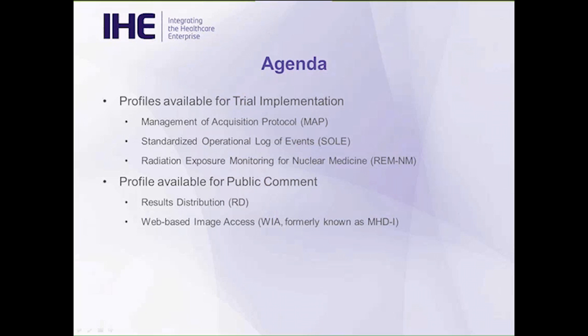The ones for implementation include the management of acquisition protocol. It's a new supplement published in 2017. This profile supports a collection of scan protocols from the acquisition modalities through their review on a protocol manager and redistribution to modalities. We're going to review the standardized operational log of events.